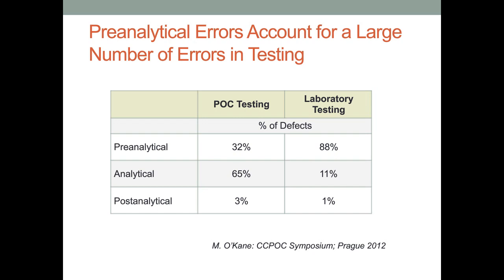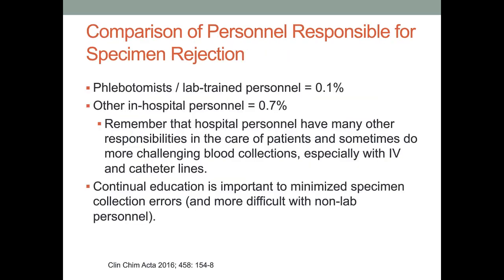When comparing personnel responsible for specimen rejection, it is relatively uncommon for rejected specimens to be caused by a phlebotomist or lab-trained person. The rate is higher, but still small, for other in-hospital personnel such as nurses, perfusionists, anesthesia techs, and doctors, who often have other responsibilities in patient care and face more challenging blood collection such as from catheters or IV lines. Continual education is important to minimize collection errors, though having less influence over non-lab personnel makes this more difficult.